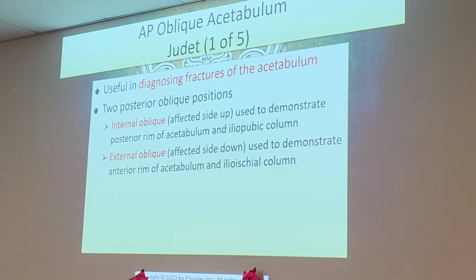Say that word. Which one? Anterior rim of acetabulum and ilioischial. Ilioischial column.